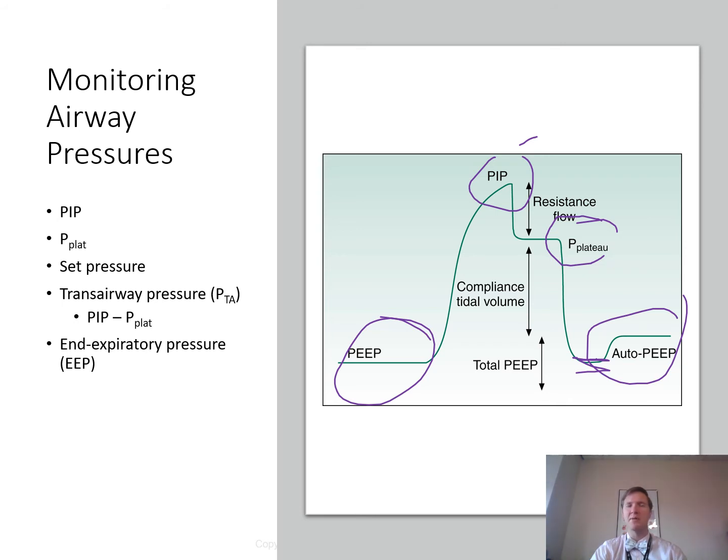And usually most microprocessor ventilators will correct for bias flow, which doesn't even appear on the graphic, so you won't even see that on the pressure time or flow time curves. But you can see it with some of the older ventilators like the LTV 1000, which had a constant bias flow of gas during exhalation at 10 liters a minute. That could change things, right? Traditionally, the presence of bias flow is usually not clinically significant and does not cause an increased resistance to exhalation, except for small infants, where it can really increase their work of breathing.